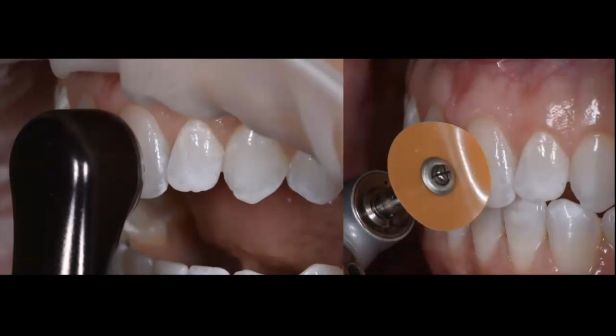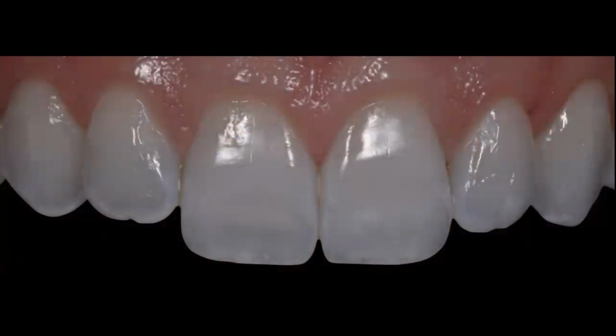Once you light cure the second time, you're not going to polish a lot. I'm just going to use a medium and fine disc, or a fine disc, because all you want to do is make sure that you eliminate any areas that are uncured, and make that area nice and shiny. You don't want to remove what you just accomplished. And this is what the surface should look like immediately after applying the resin infiltrant. As you can see, there is no more white spot left. This is immediately after, so the teeth are still dehydrated.